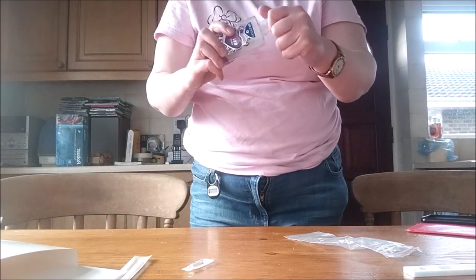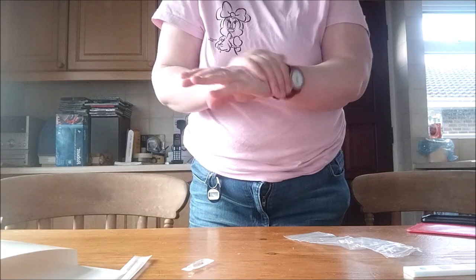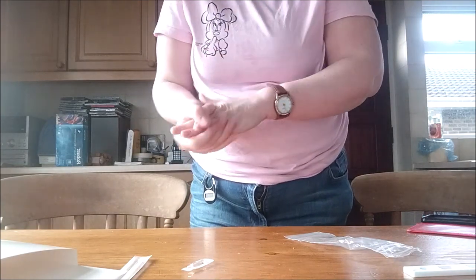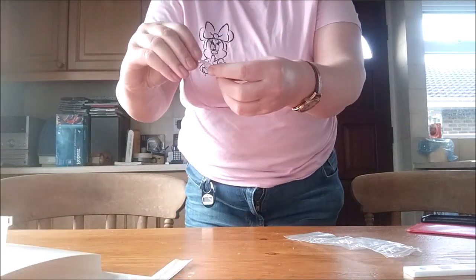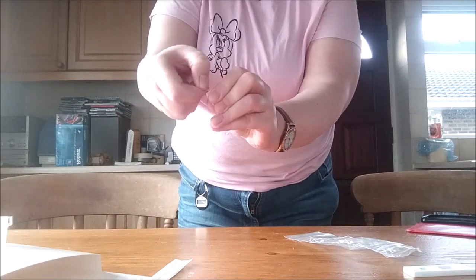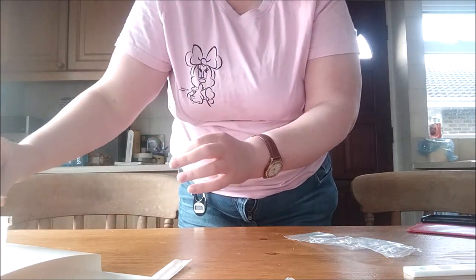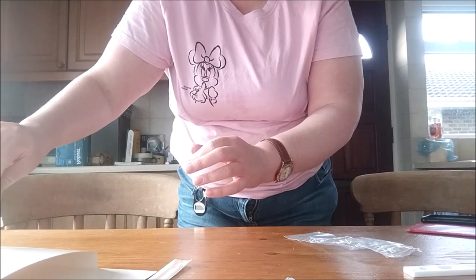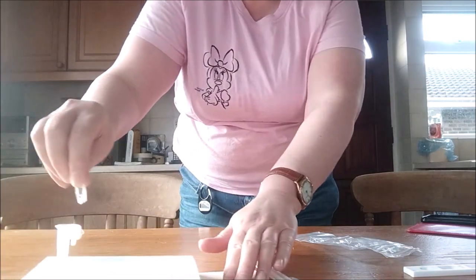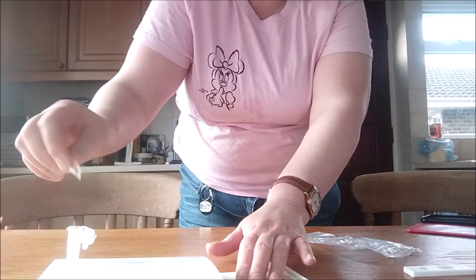The first and most important thing is you must always sanitise your hands, like so. What you do is, you break that off, like so, and you pour into the extraction tube, like so.